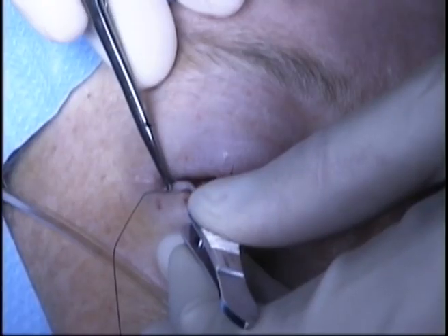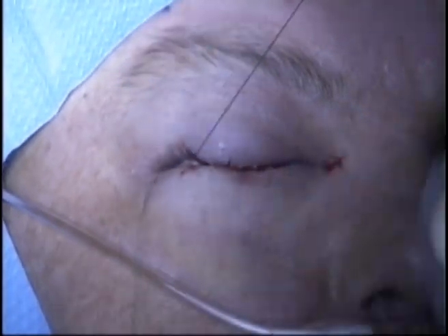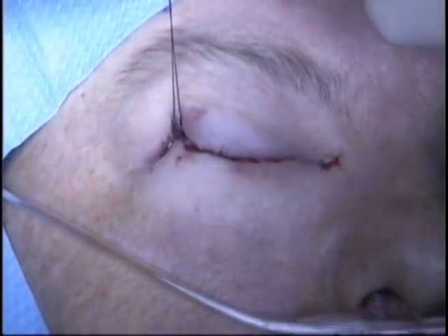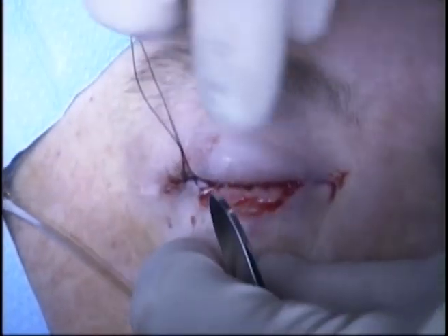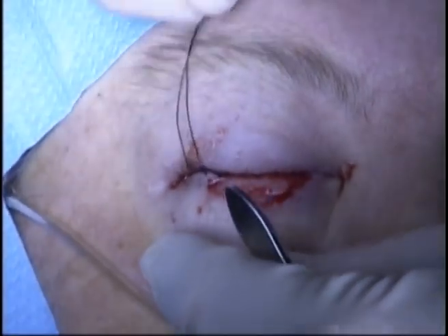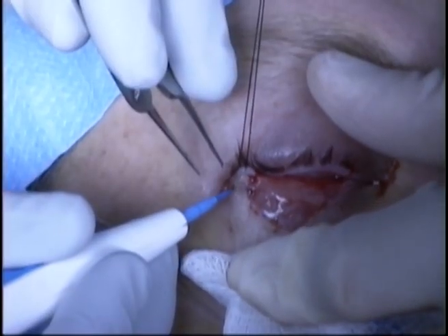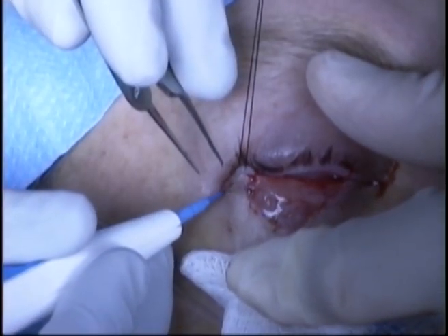Numerous different procedures could be performed in cases that involve approximately 50% of the lower lid. In this case, the patient had poor vision in the contralateral eye and did not want a Hughes flap performed.